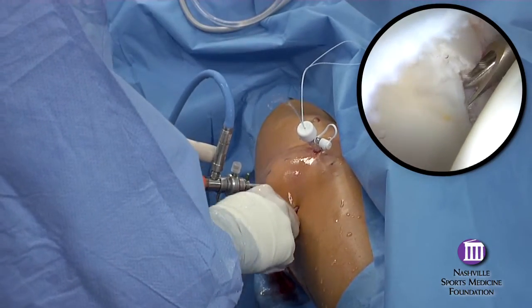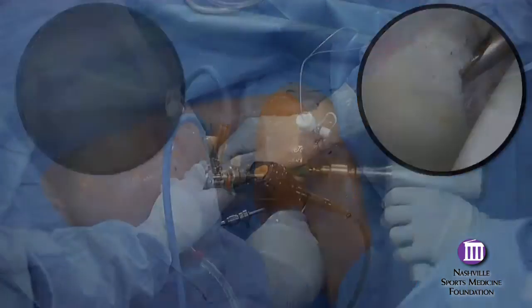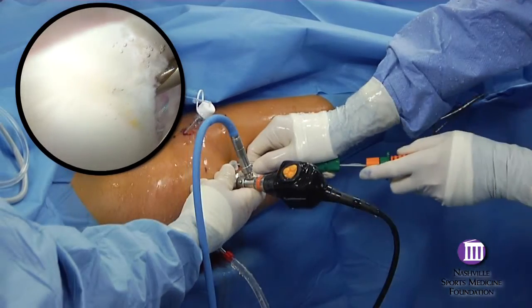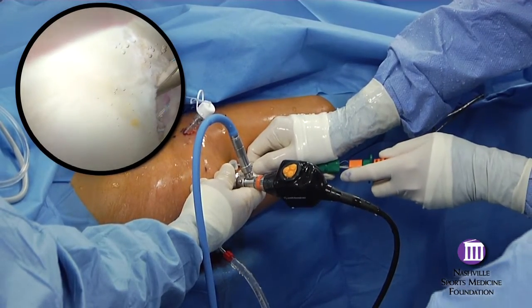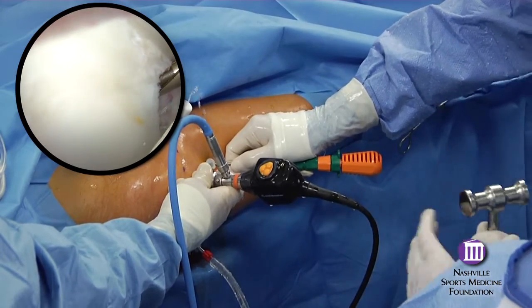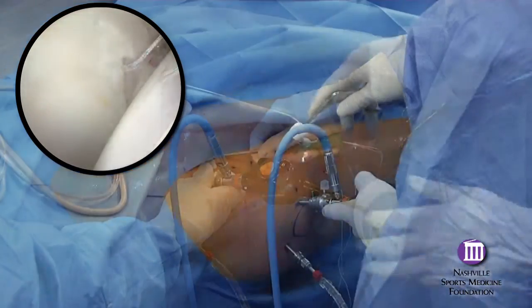In this case, a cannulated drill sleeve alone can be used. It is the distal entry site that allows the anchor to be placed adjacent to but not perforating the articular surface. If the anchor is placed too far away from the rim, anatomic re-approximation of the labrum cannot be achieved.